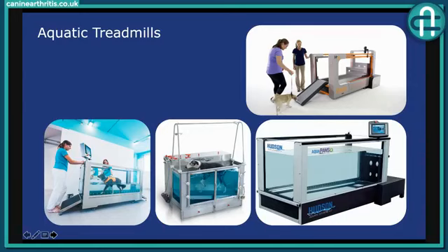So yep. Another practical thing is, if your pet doesn't enjoy it the first time round, don't immediately write it off. Anecdotally, and no research has been done on dogs, they've only looked in horses, but anecdotally, in a sound uninjured dog, it takes 2 sessions to really acclimatise to these underwater treadmills. So really give it 2 sessions at least before you make a decision whether your pet's going to benefit, and your physical therapist or hydrotherapist will talk you through that too.